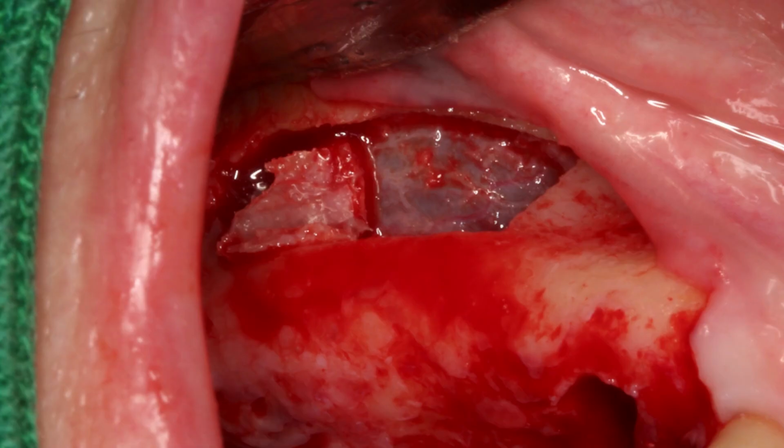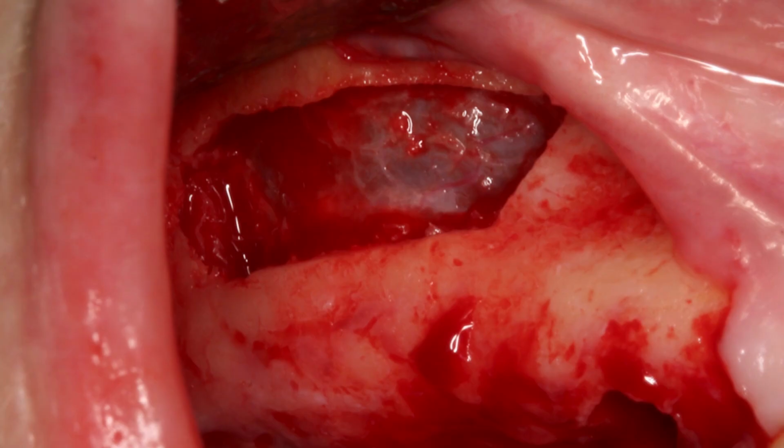There's a little incident that we had when we actually pulled this window off. It didn't quite come off easily. It actually broke. It was quite thick, and it actually snapped in the middle, which tends to happen a lot. So by the time we further instrumented with the piezoelectric surgery device, the saw tip, and then ultimately got to the back, we got better, but there's still a little bit of that sharp edge remaining. There are a number of different instruments. We can use different cutting instruments, or to me a rongeur, a bone rongeur, for finishing off the edges. Using direct vision, the piezoelectric surgery tip works quite well.